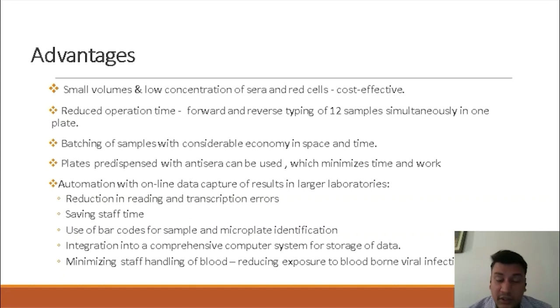This greatly reduces reading and transcription errors and saves staff time. Also, barcoding facilities are available for positive sample identification. And then integration with a computer system is there for storage of data. It also minimizes staff handling by automation, thereby reducing the exposure to bloodborne and viral infections.